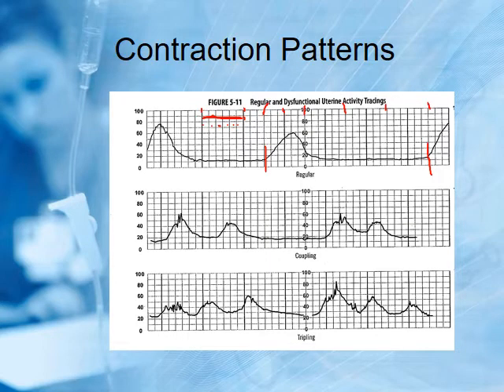When I say every third line in, do you see that? 1, 2, 3. That's where that starts. 1, 2, 3. Oops, I went too far. 2, 3. So that's where I'm counting from here to here to here to here. 1, 2, 3, and then one more. 4 minutes apart. Can you see that?